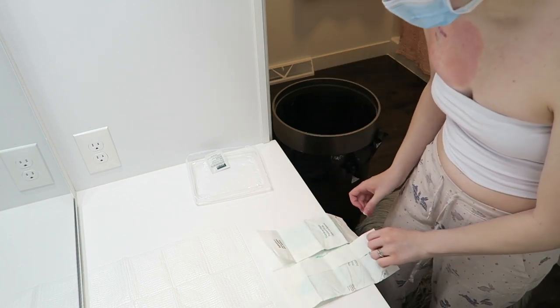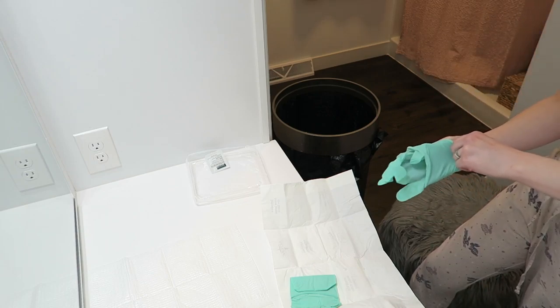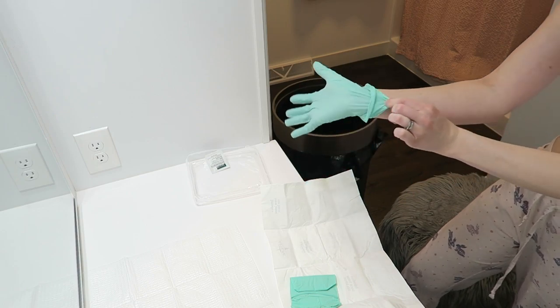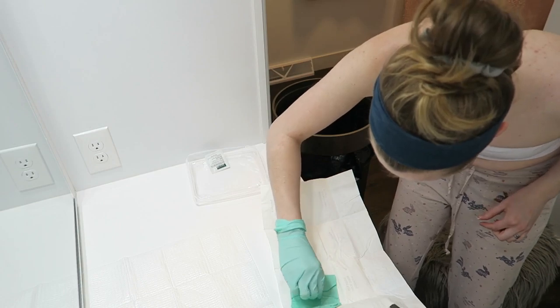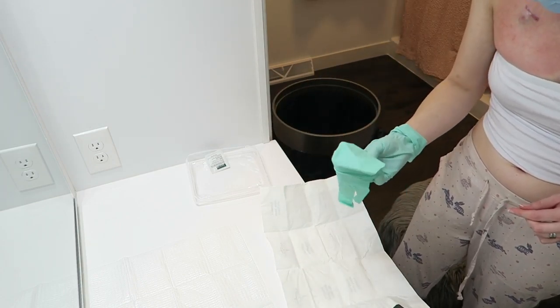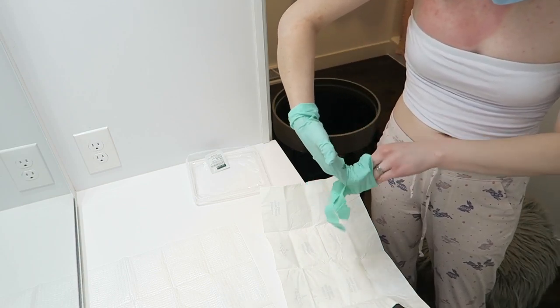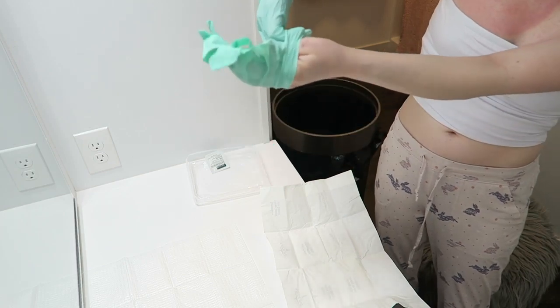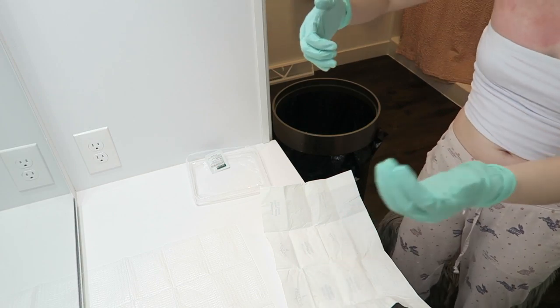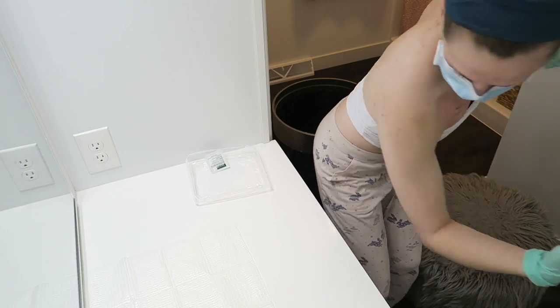As you can see, the gloves are a lot bigger. Again, slide it in. These are so much easier to get on. Then you can pull it down. Grab this one. Slide your hand in the cup. And slide this one in. Just like that. You do not want to touch the paper with your sterile hands. So we are going to drop that.